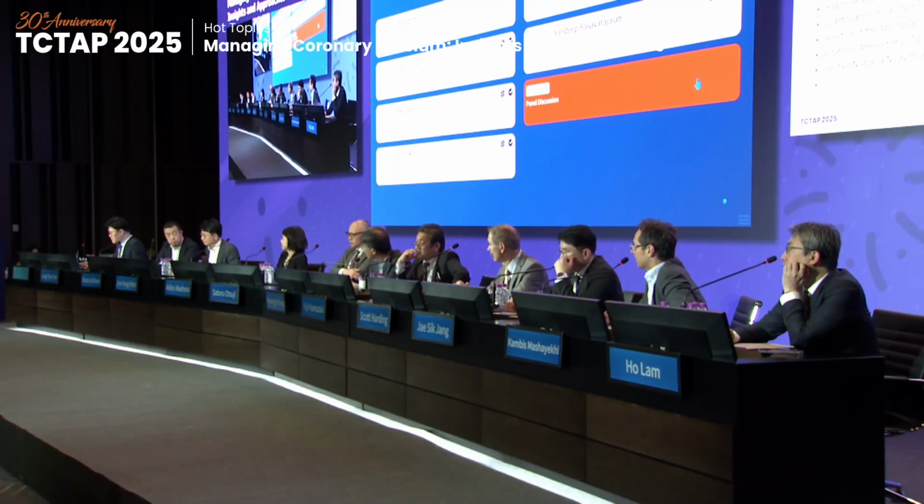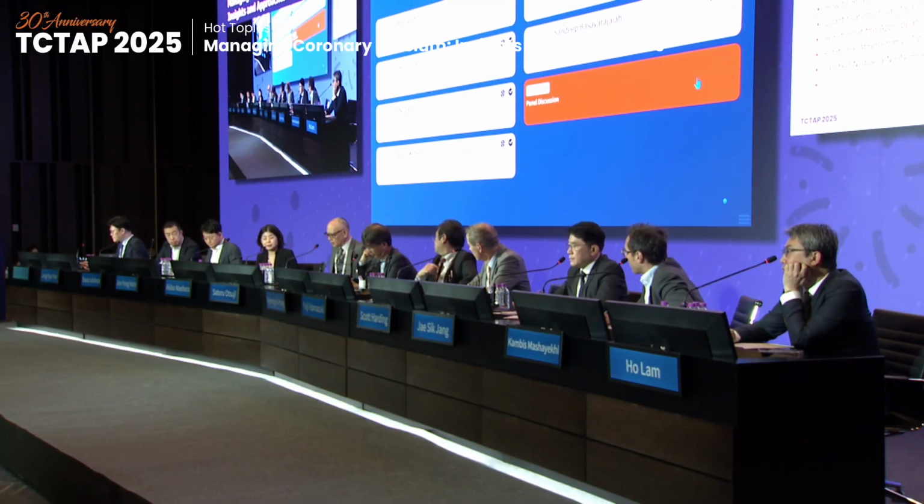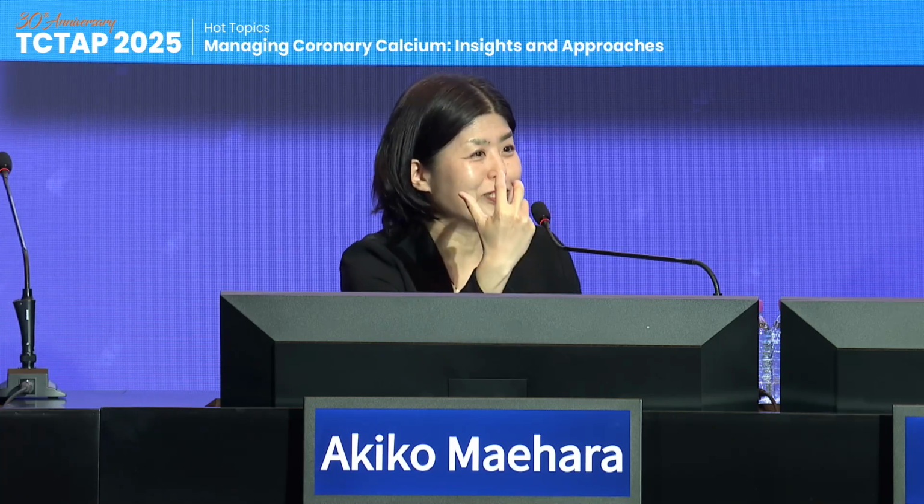Any comment? I want to mention a little bit in terms of the calcified nodule. We have had a very nice talk today, but there are two important aspects not mentioned yet. Number one, whenever we see the calcified nodule, we are overestimating the diameter stenosis most of the time, because the calcified nodule is protruding and behind it there is a space. Most of the time we have a much larger lumen when we do the imaging. Because this is a very difficult animal, before starting treatment we really have to ask ourselves whether this is physiologically significant. That's very important.